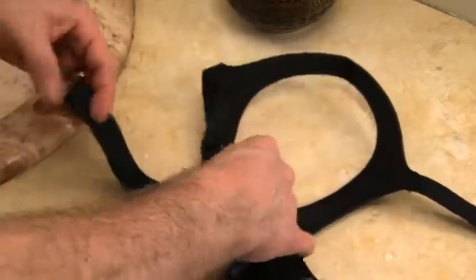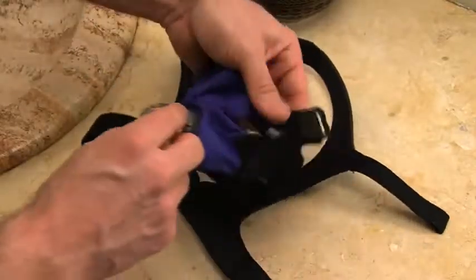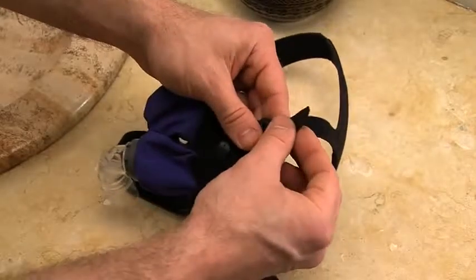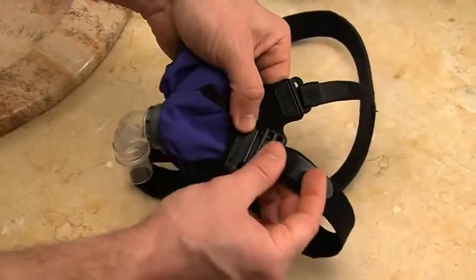Snap the male double clip into the female quick release clip on the mask. Make sure each side is firmly attached. Note: keep all straps open to the widest position. Your mask is now ready to put on.